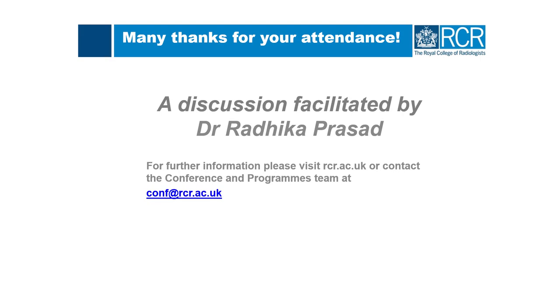So regarding dural sinus thromboses, do the thrombus enhance? Not to my knowledge. When you give the contrast in a CT, it should actually be a filling defect, like I showed with that particular case. So rather than enhancing, it should just be a filling defect.